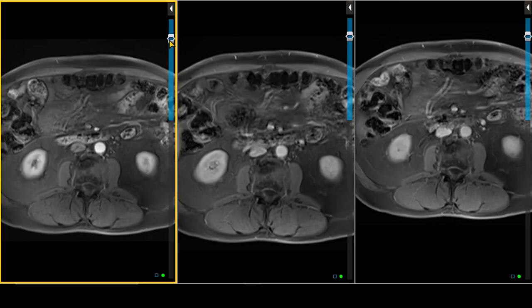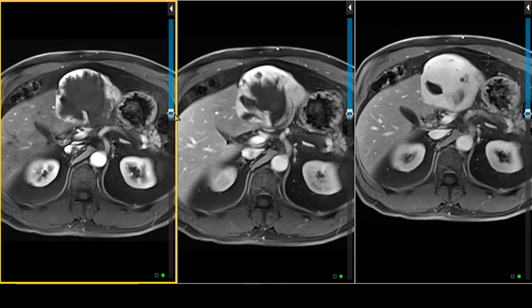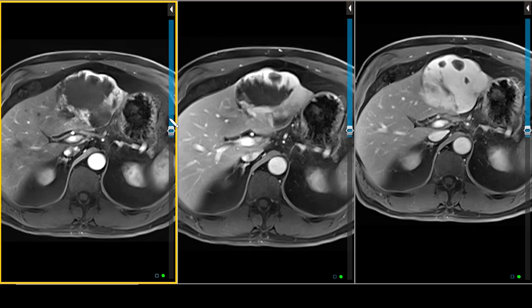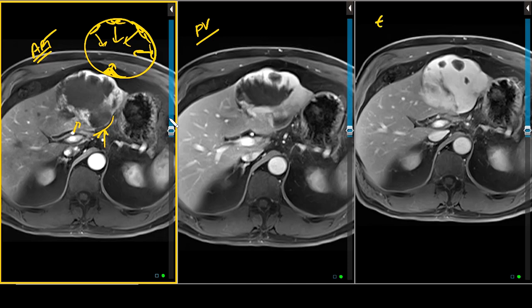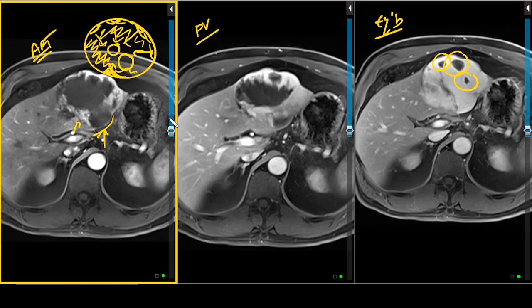Here we have our dynamic post-contrast images of this lesion in the left hepatic lobe. On the arterial phase images, the lesion shows peripheral enhancement and puddling of contrast that is discontinuous. On the portal venous phase, contrast extends centrally and starts to fill in the lesion. On the equilibrium phase, much of the lesion is filled with contrast except for those areas that were relatively bright on T2 and relatively dark on T1 — certain pockets that never fill up with contrast.